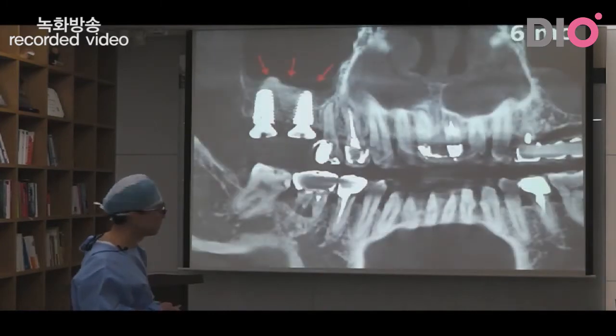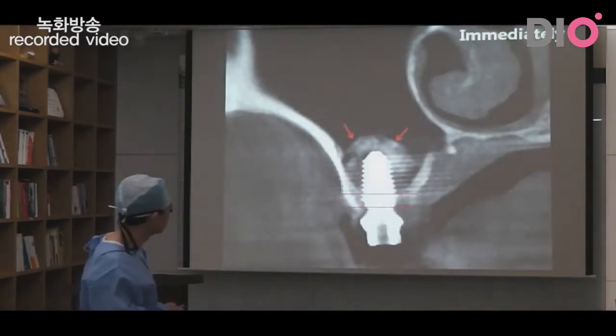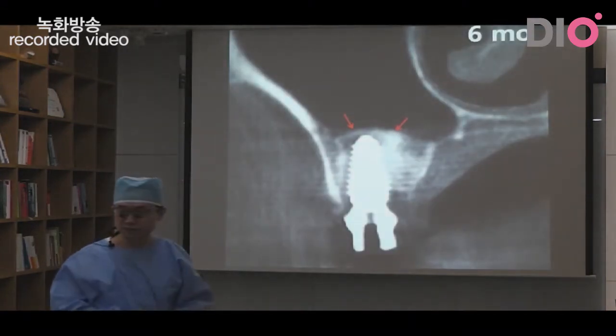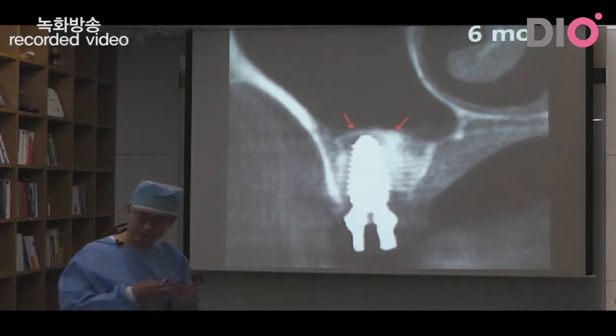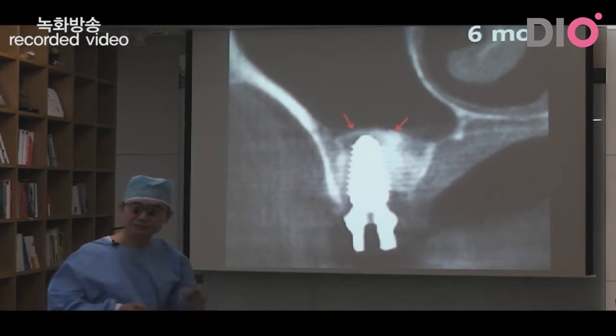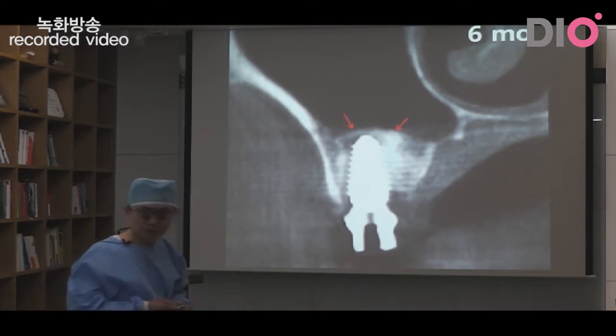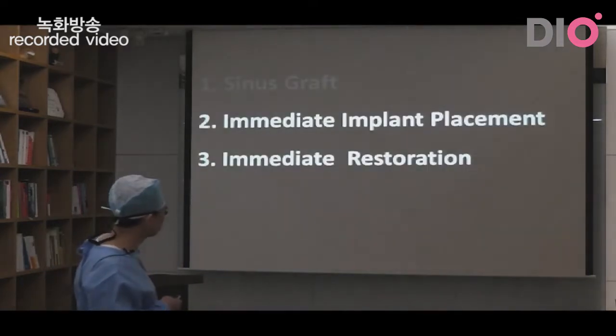This is immediately and 6 months after procedure. That shows that the collagen sponge can keep the elevated Schneiderian membrane in maintenance and can play a role to make bone tissue in the sinus cavity.